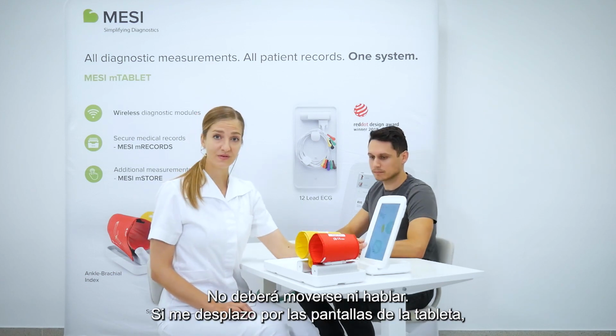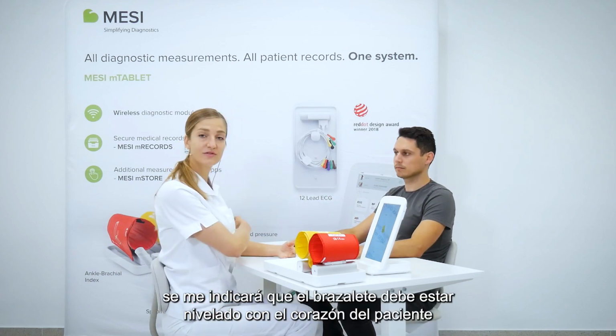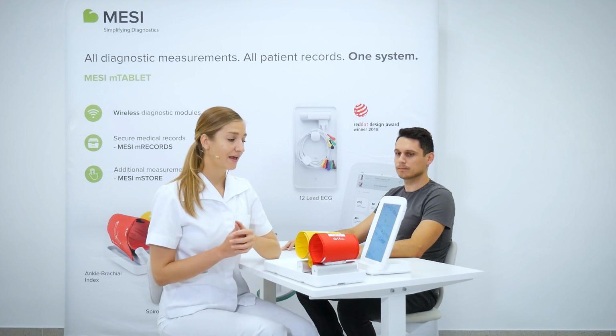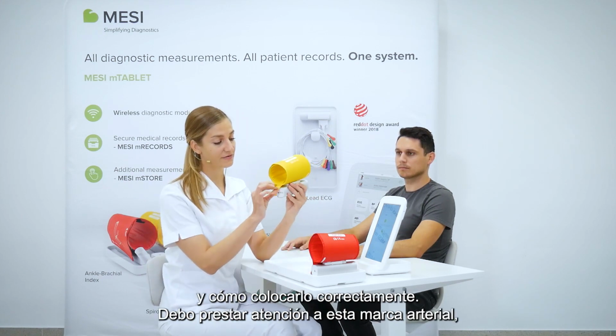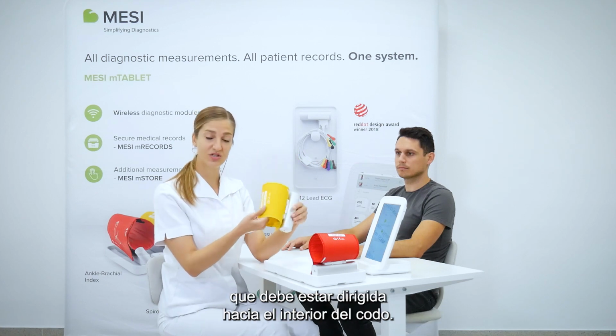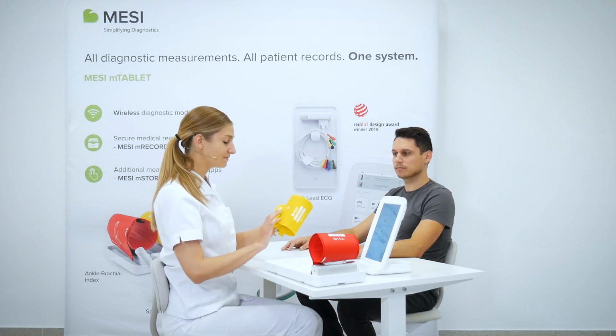If I scroll through the screens on the tablet, I get instructions that the cuff should be level with the patient's heart, and I get clear instructions how to place the cuff correctly. I have to be mindful of this artery mark, which needs to be pointing towards the inside of the elbow.